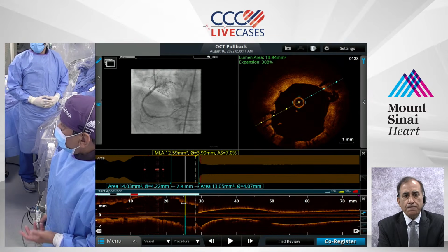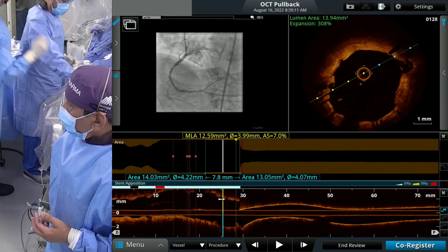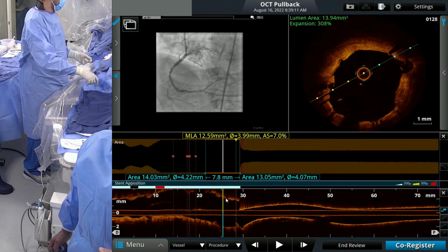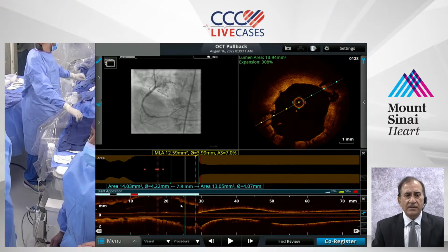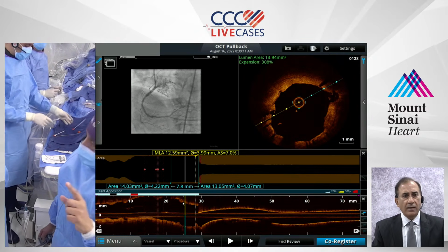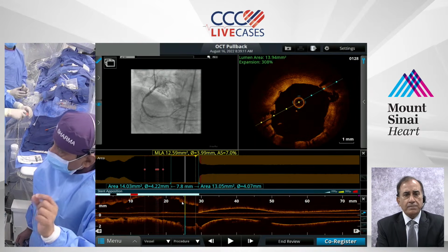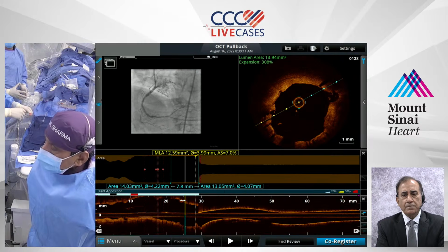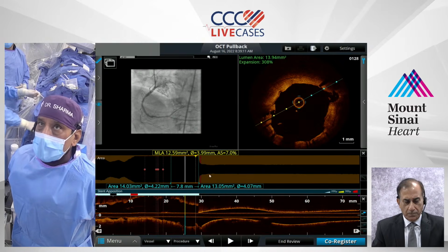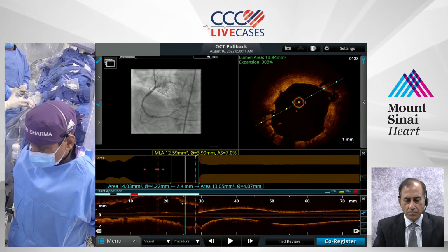I think you know, the understanding with the depth, yes, but not this kind of crisp picture that you would have seen. Absolutely. So I think we would not have understood the mechanism this well, at this level of resolution and imaging. But more important is because we did not have calcium. If calcium would have been there, IVUS would not have been that precise. This case does not have much calcium, but if there is calcium, differentiating the calcium from the stent is very hard. For this case, I also showed and explained the mechanism. But in a calcified lesion, OCT is of course better.